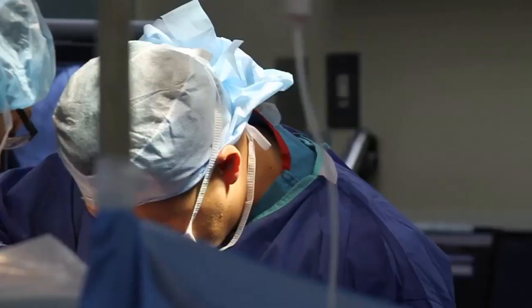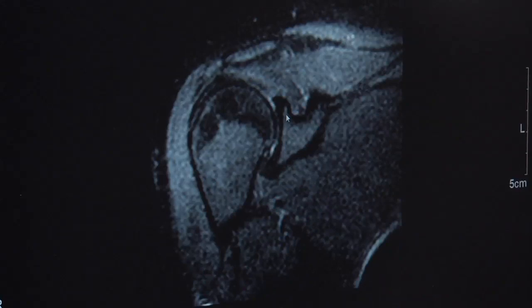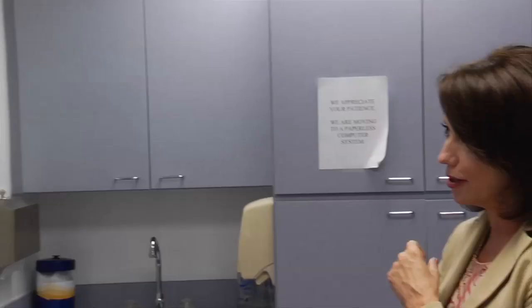Arthroscopy is a common treatment for rotator cuff repair and labral tears, and it's now done as an outpatient procedure. The basic premise is to do as little damage as possible to get in and exact the maximal benefit. If it's caught and repaired early enough, the arthroscopic shoulder procedure leaves patients with years of pain-free movement and function. For Lee Memorial Health System, I'm Amy Osher.